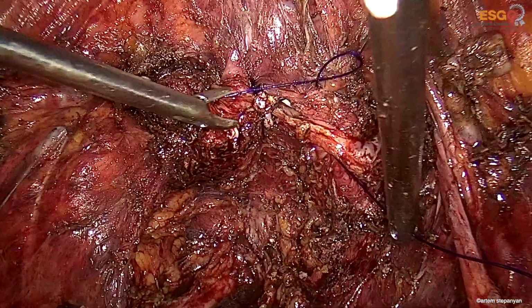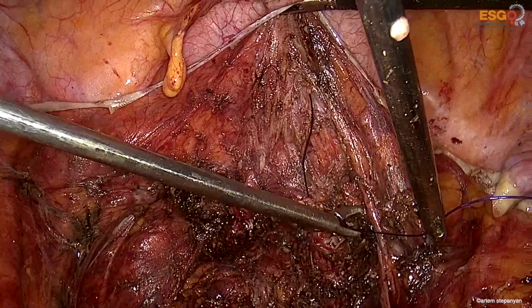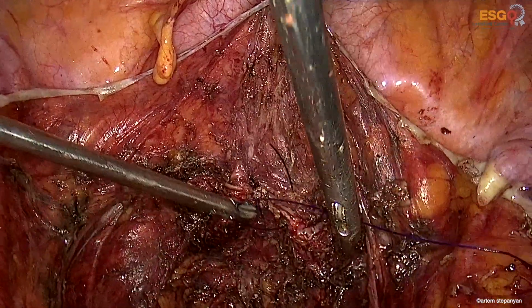This approach is good to avoid the vaginal prolapse in the future.